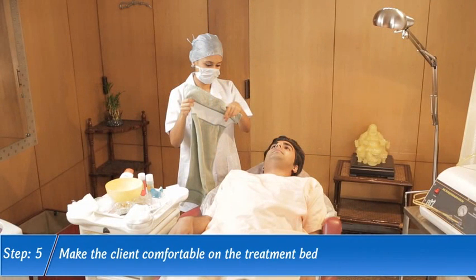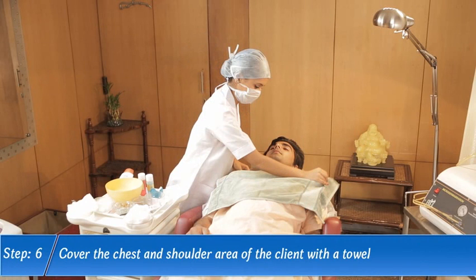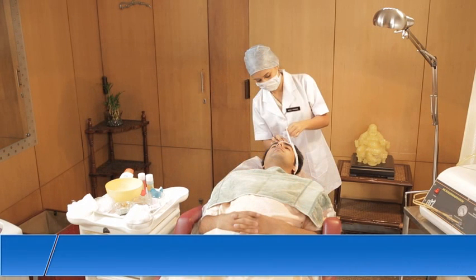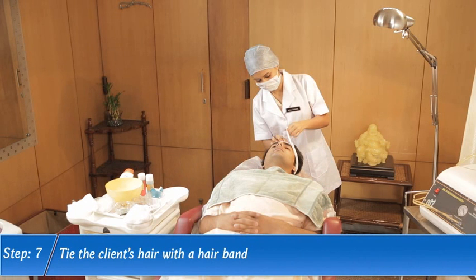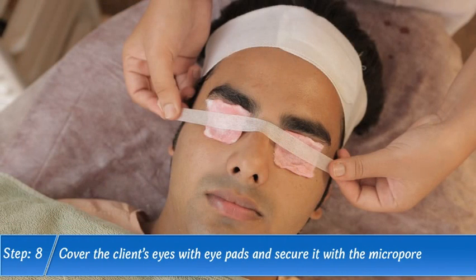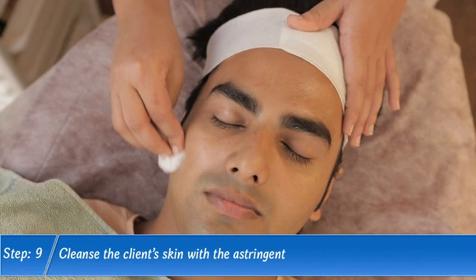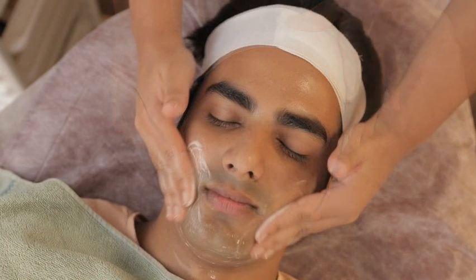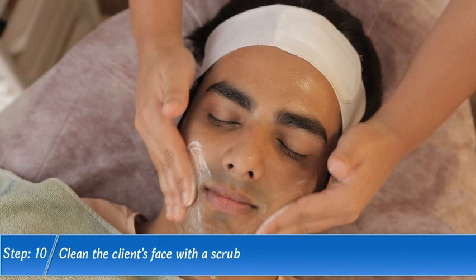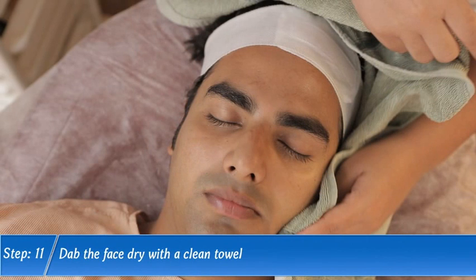Step 5. Make the client comfortable on the treatment bed. Step 6. Cover the chest and shoulder area of the client with a towel. Step 7. Tie the client's hair with a hairband. Step 8. Cover the client's eyes with eye pads and secure it with a micropore. Step 9. Cleanse the client's skin with the astringent. Step 10. Clean the client's face with a scrub. Step 11. Dab the face dry with a clean towel.